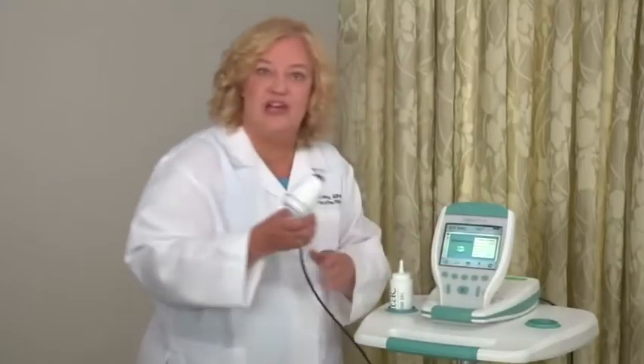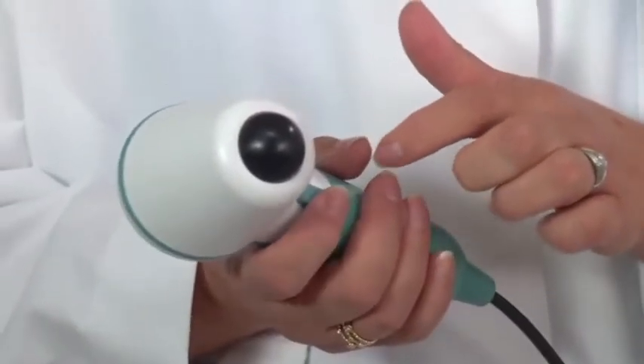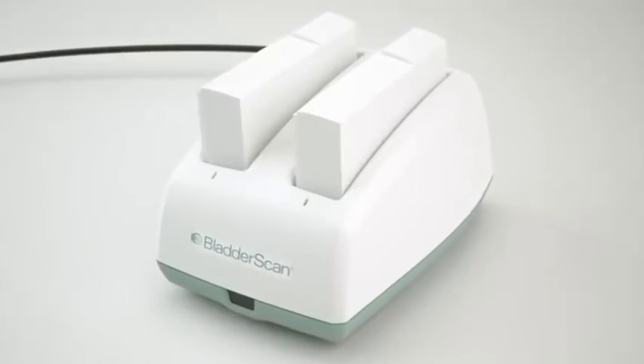It also has an ultrasound probe that scans the patient's bladder and needs to be wiped with alcohol between patients. This is the button that is pressed to perform the scan. The Bladder Scan has a combination battery, charger, and wireless hub. It comes with a manual, and I recommend you review it before you use the device.